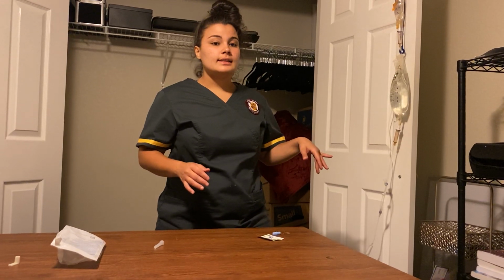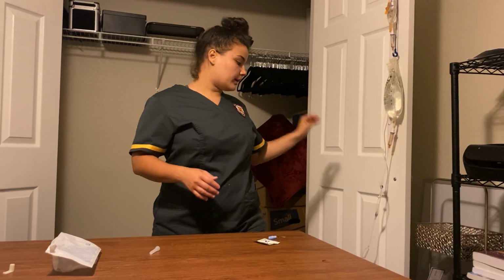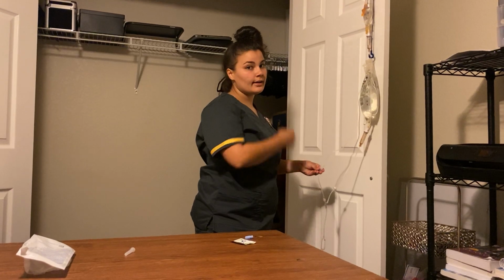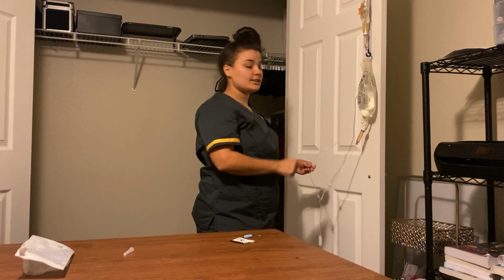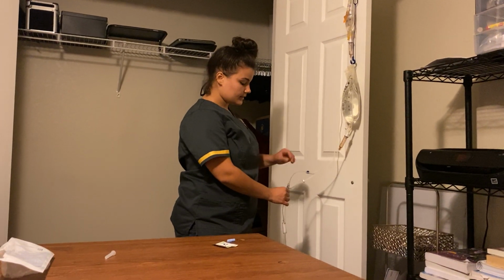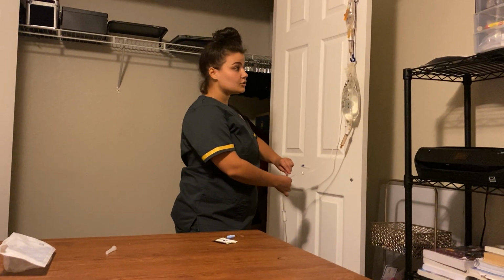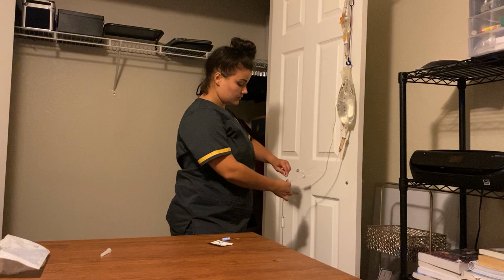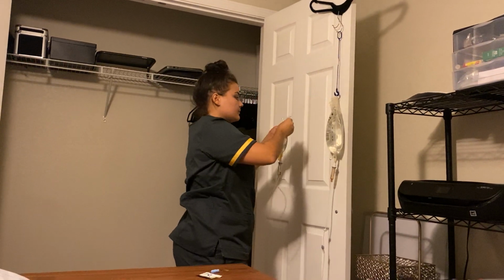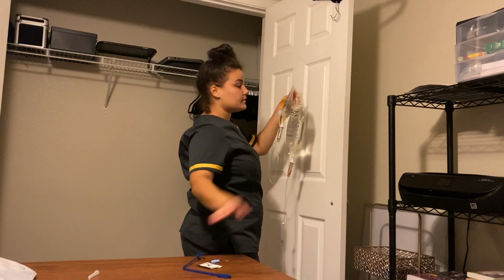So let's say that I want to go and discontinue this. What I'm going to do is make sure that this is closed all the way down. My regulator clamp on my medication is closed all the way down. All right. I'm going to get this and untwist it. All right. I'm going to get my medication. Also, I have to hang this back up into the higher position.